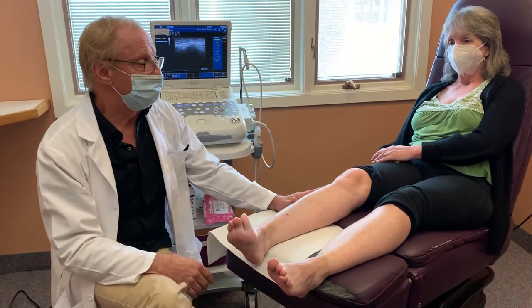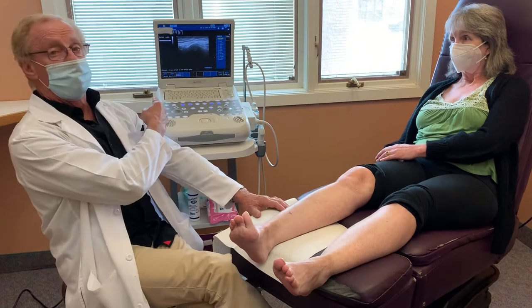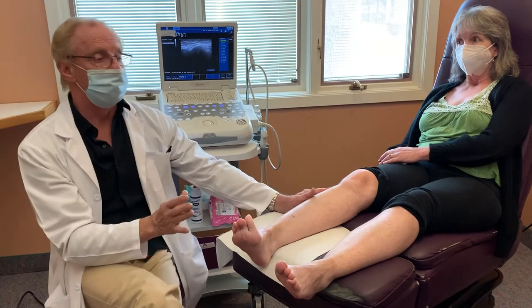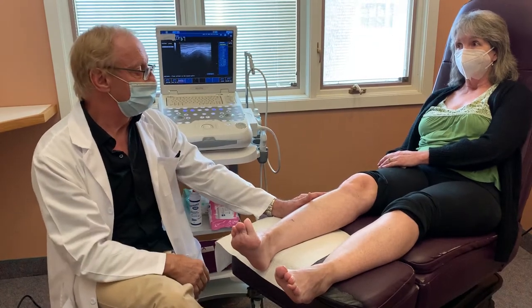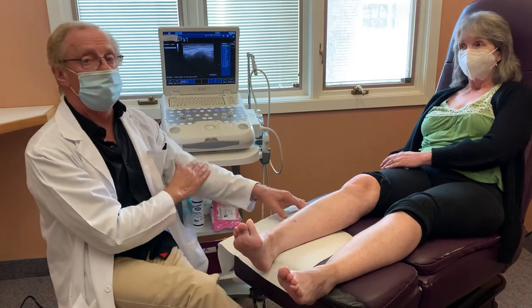There are about five muscles that drop foot affects. We're going to talk about ultrasound — that's the topic. We're going to talk about how ultrasound, and this is an ultrasound machine, how we can actually look at these nerves and see how the pressure on these nerves creates a change in the shape of the nerve. Shea had a really excellent example of this when she did her ultrasound.